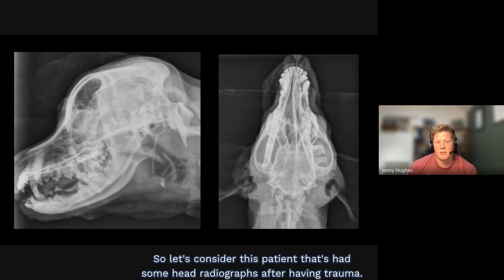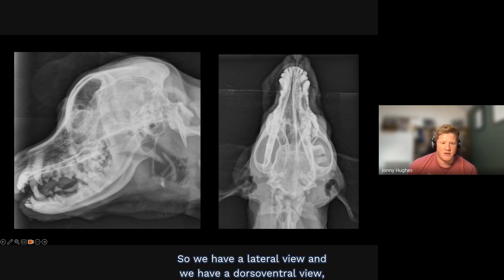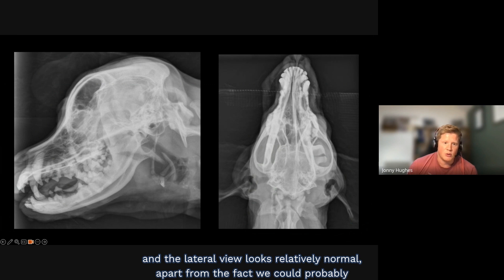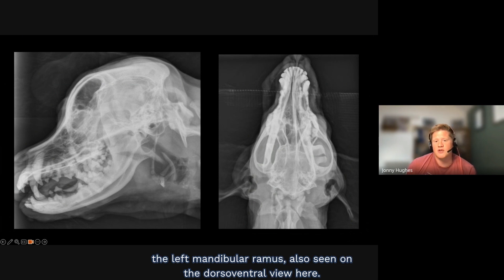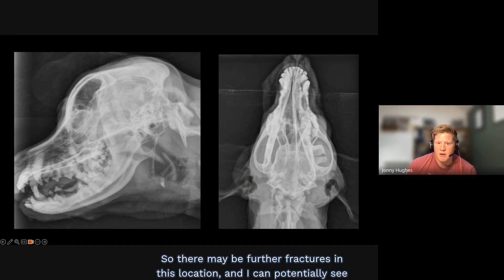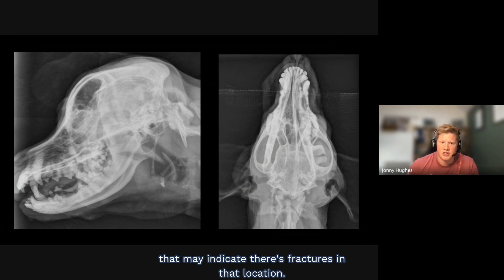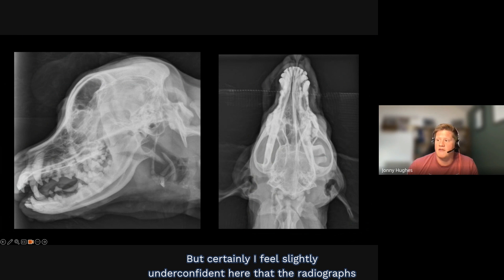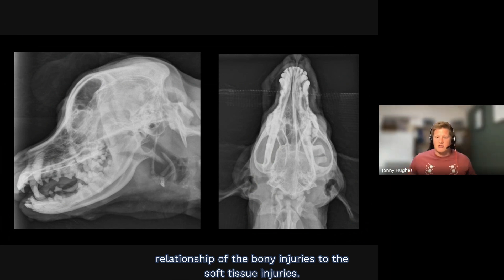Consider this patient that's had head radiographs after trauma. On the lateral and dorsoventral views, the lateral view looks relatively normal apart from a dorsoventral fissure running through the coronoid process of the left mandibular ramus, also seen on the dorsoventral view. There's some heterogeneous lucency of the mandible and malalignment overlying the maxilla on the left side, suggesting further fractures, and a poorly defined lucency in the condylar process of the left mandible may indicate fractures in that location.